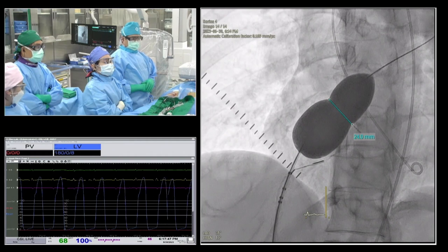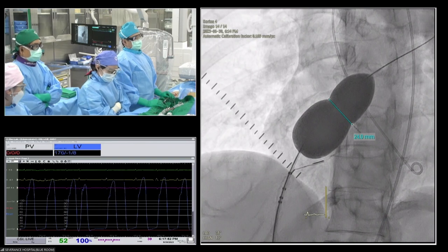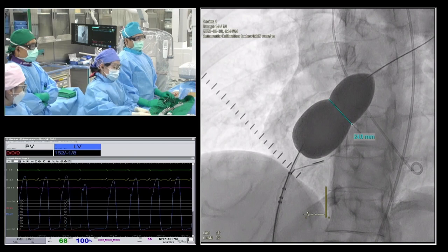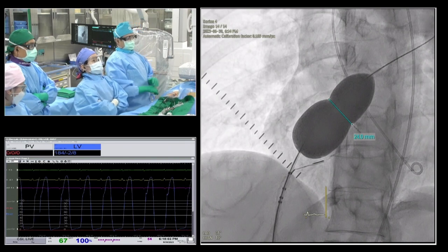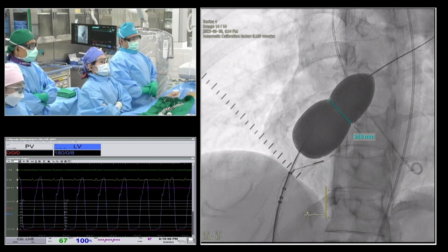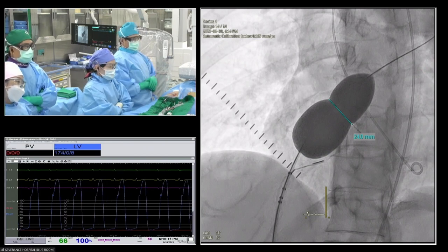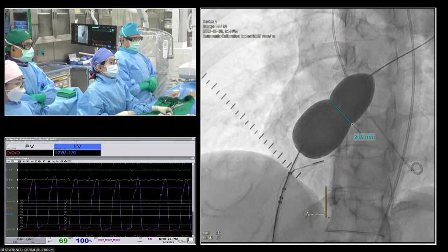But how big should it be? I think it's going to be around 8 millimeter, is that correct? With 8 millimeter, spontaneous closure may not be achieved. So about 5 millimeter, in most of the cases, spontaneous closure may occur. So my practice is, if the pressure elevation is not so serious, then two or four small holes. Or if we expect it to sustain for months, then maybe a 5 millimeter fenestration.